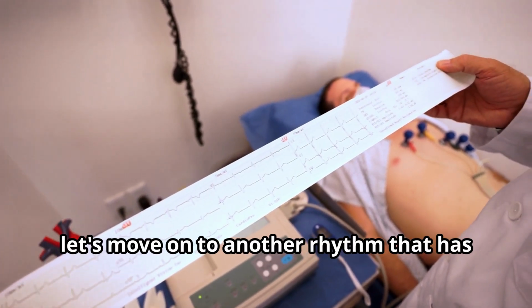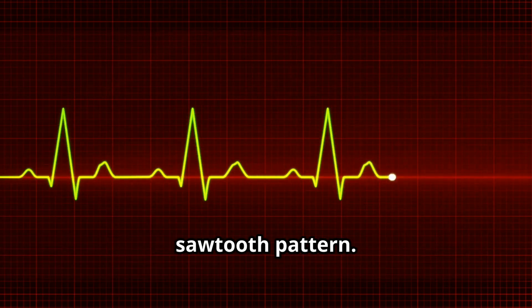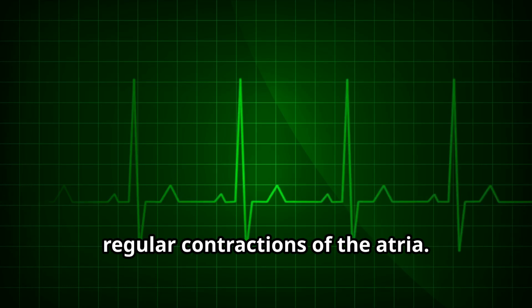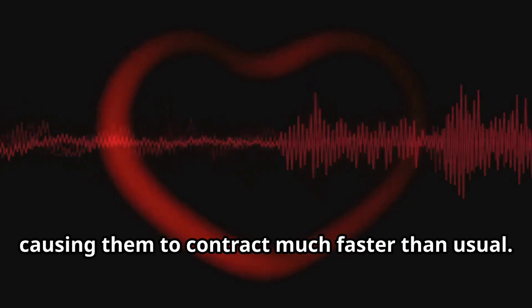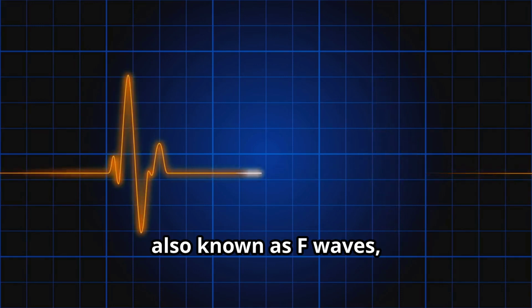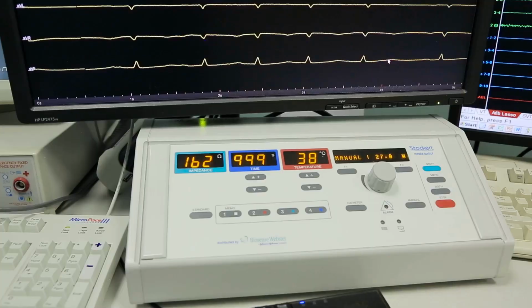Now let's move on to another rhythm that has a very distinctive look on the ECG, atrial flutter. This one is all about that classic sawtooth pattern. Imagine those triangular teeth one after the other. That's what atrial flutter looks like on an ECG. This pattern is created by the rapid, regular contractions of the atria. See, in atrial flutter, the electrical impulses travel around the atria in a circuit, causing them to contract much faster than usual. This rapid, organized atrial activity produces those characteristic sawtooth waves, also known as F waves, on the ECG. It's a dead giveaway for atrial flutter.